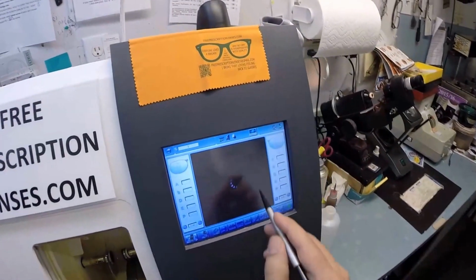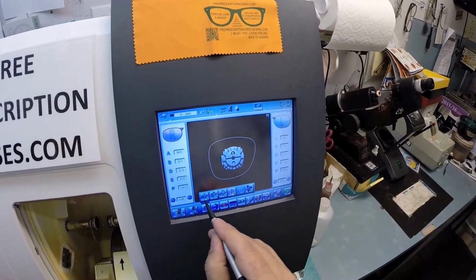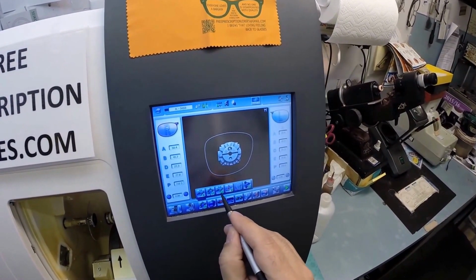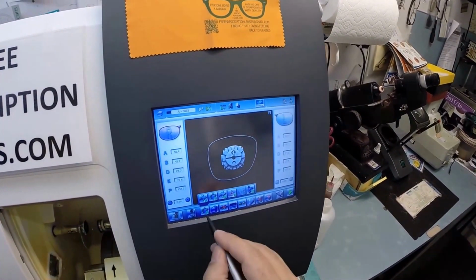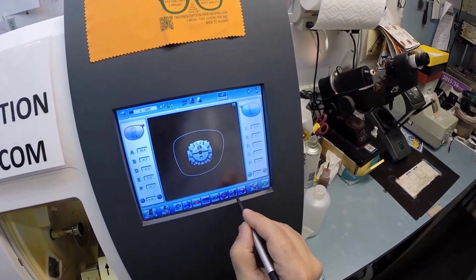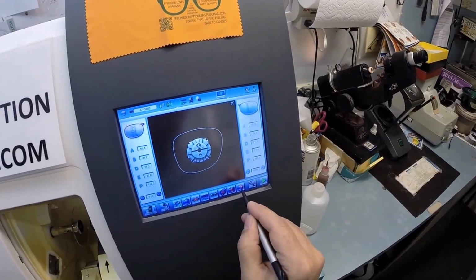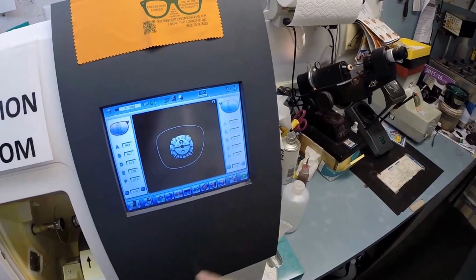I'm going to wake up the computer to tell it so it knows what shape lens to cut. That is it. These are polycarbonate lenses. If they were plastic, high index plastic or Trivex, I would select that. But we're going to stay on polycarbonate. I do not want to polish the edge of your lens. I'm not going to put a bevel on the front surface, the convex surface of the lens. I'm only going to put one on the rear concave surface of the lens.